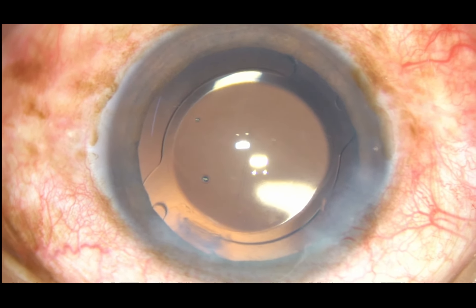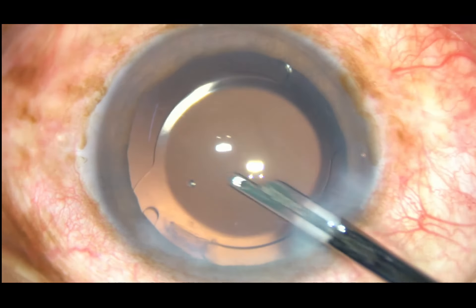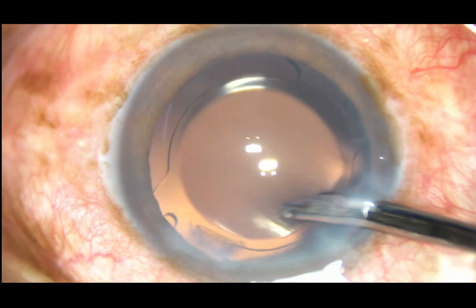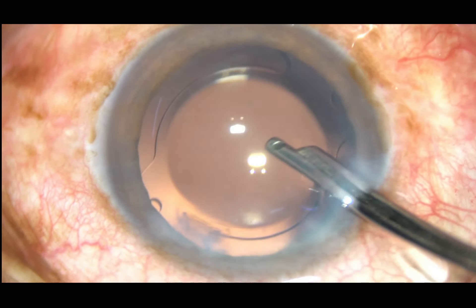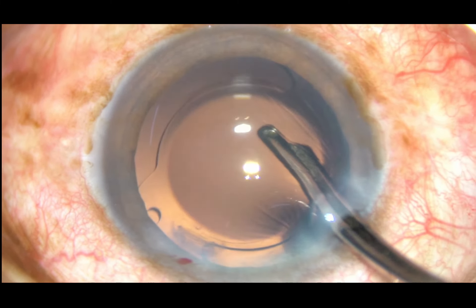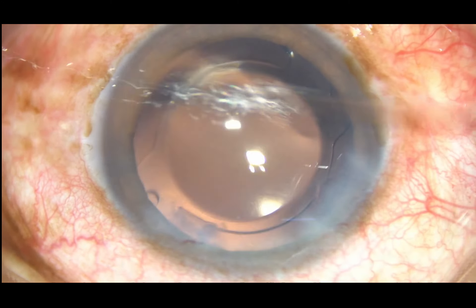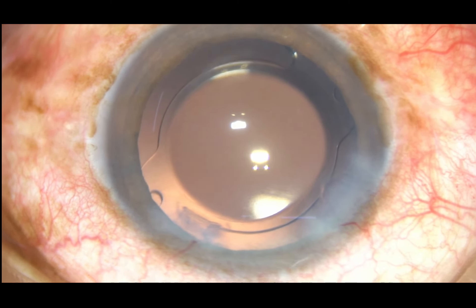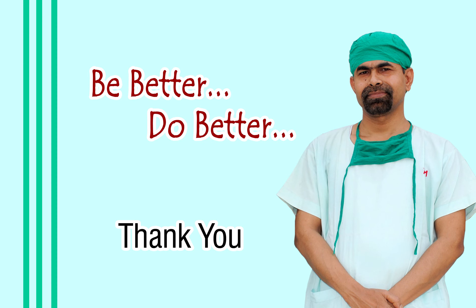A final lavage of the anterior chamber is done. I remove all particles and leave the eye with fresh BSS. Thank you very much for watching. Hope this video will help you in developing your surgical skills. Please learn direct chop and you will need very minimal ultrasonic energy.